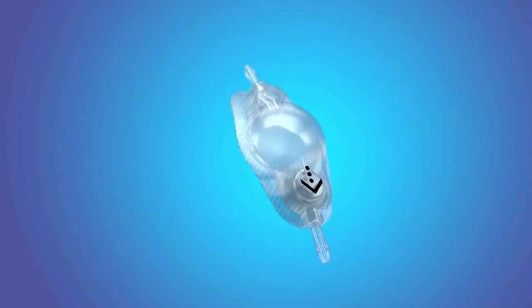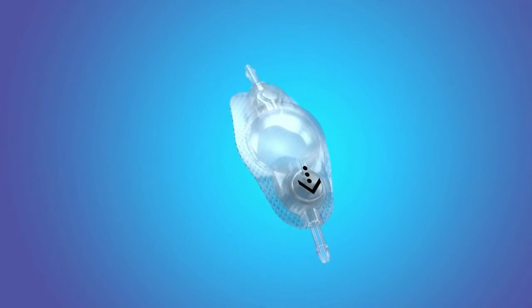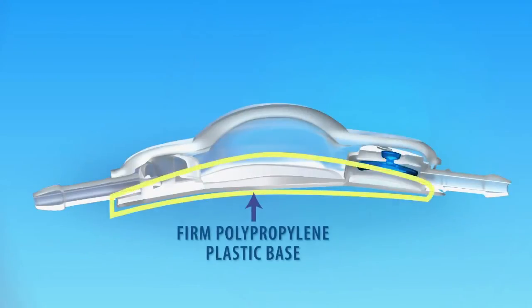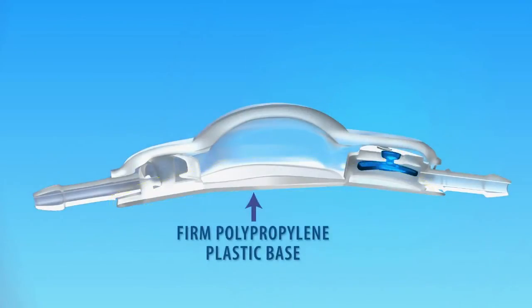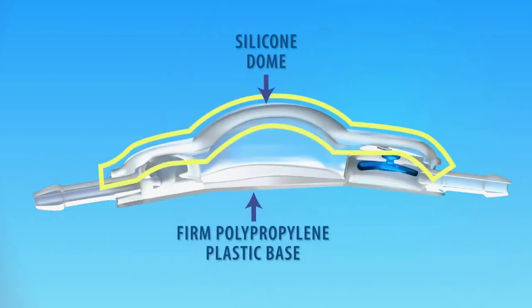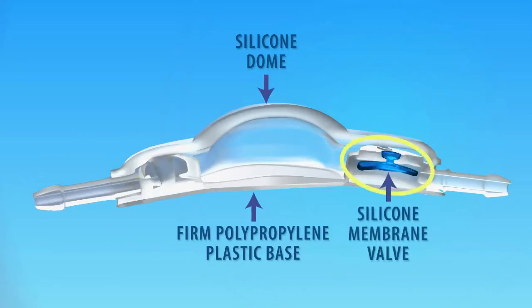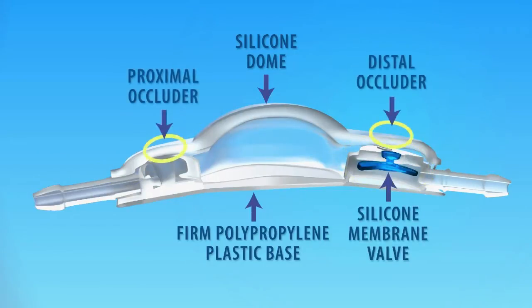The Medtronic contoured valve consists of a polypropylene base, a silicone dome, and a silicone membrane valve. The contoured valve also has proximal and distal occluders for selective flushing.